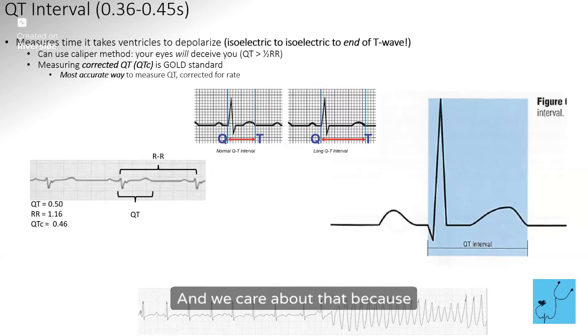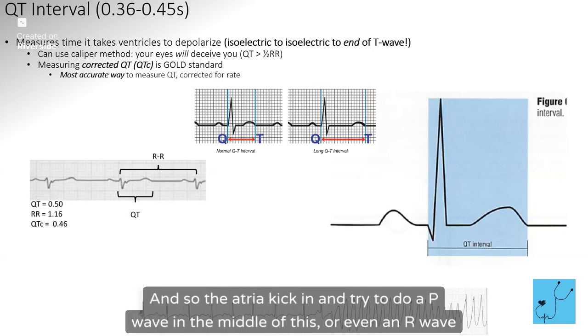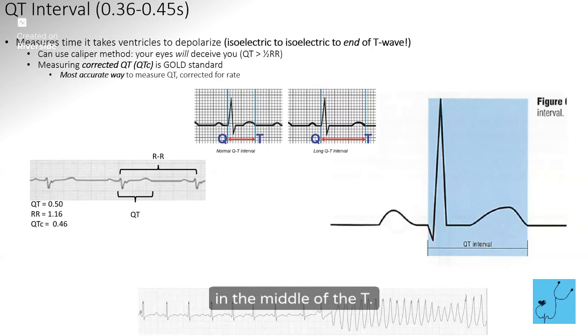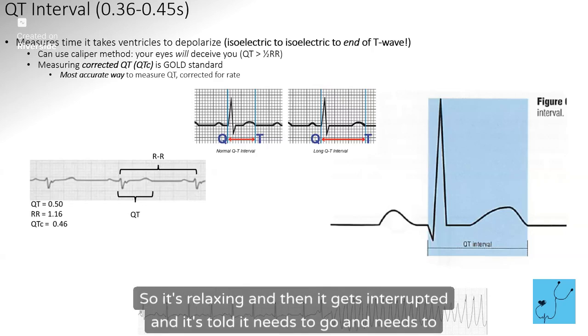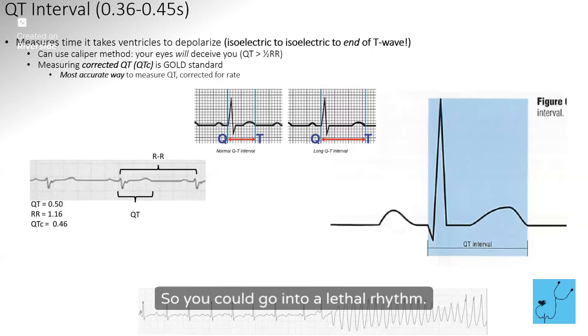And we care about that because if this gets longer and longer and longer, it can then butt into the next beat. And so the atria kick in and try to do a P wave in the middle of this, or even an R wave in the middle of the T. So it's relaxing and then it gets interrupted and it's told it needs to keep working. And so you could go into a lethal rhythm.